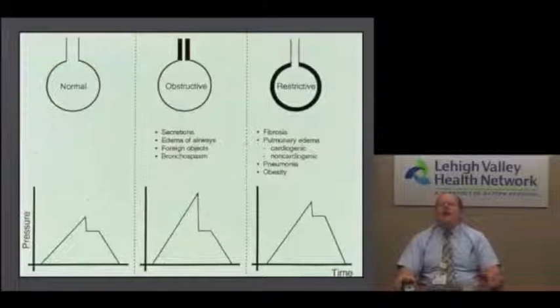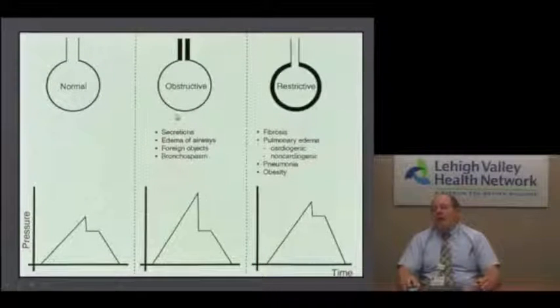So when you have a high airway pressure, what's going on with the patient? An airway pressure of 25 and a plateau pressure of 15, that's kind of normal. Now, if my airway pressure shoots up to 40, but my plateau pressure stays at 15, I know that's not a lung problem because my plateau did not move. It's not indicative of alveolar pressure, it's indicative of airway pressure, and that would be obstruction, see? I know then that if my PIP goes up but my plateau doesn't, I need to suction the patient, maybe give beta agonists, bronchoscopies, those types of things.